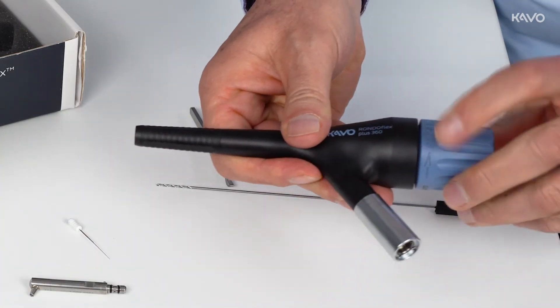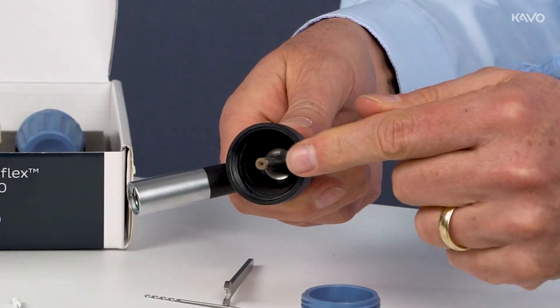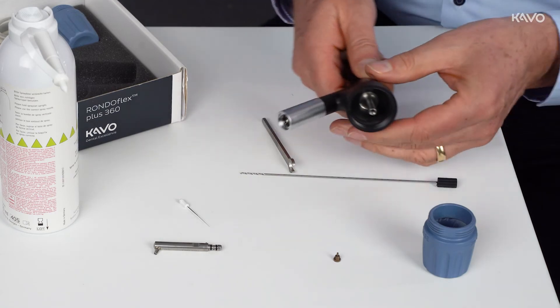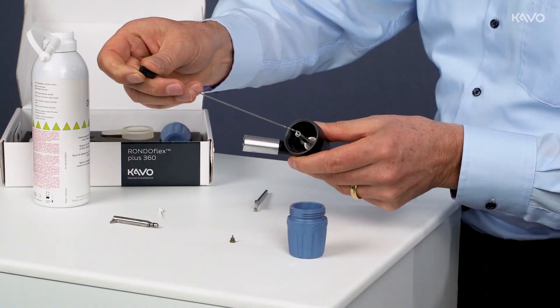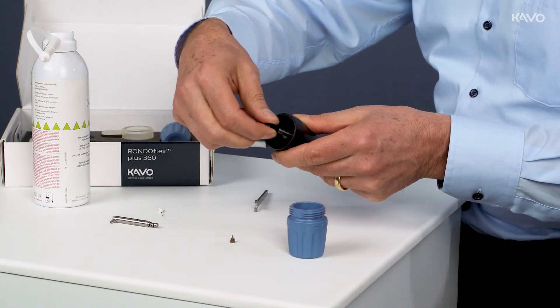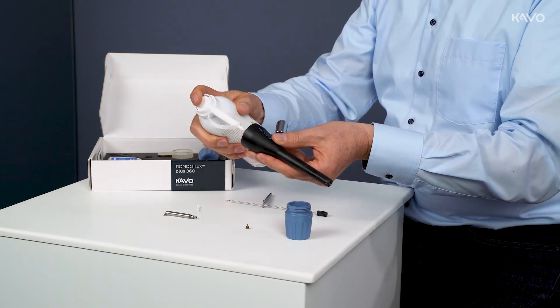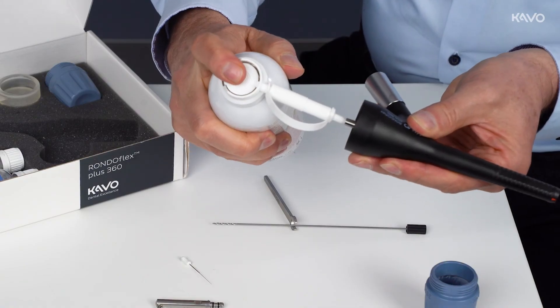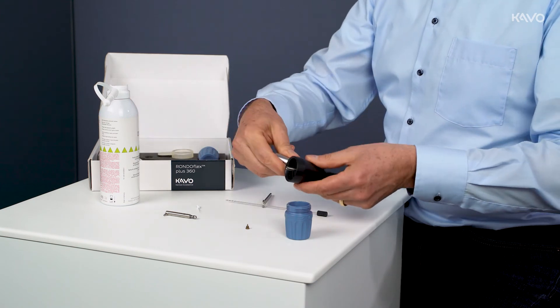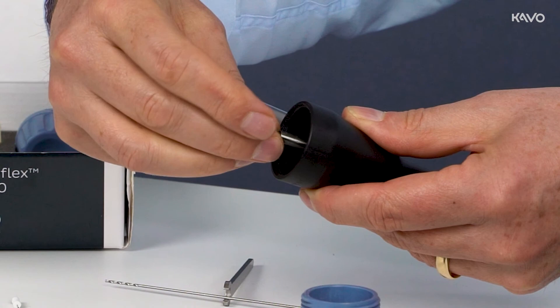If the base body is clogged, first unscrew the powder container and then the nozzle. Then insert the long cleaning tube into the base body using slight pressure. Turn the cleaning tube a maximum of 360 degrees using slight pressure and then pull it out. Repeat this process frequently until the blockage is cleared, then spray through with CAVO dry spray. The nozzle can then be screwed back on carefully with a little force.